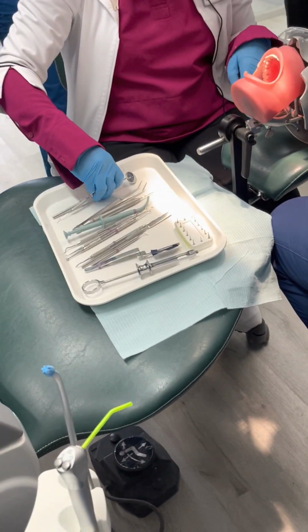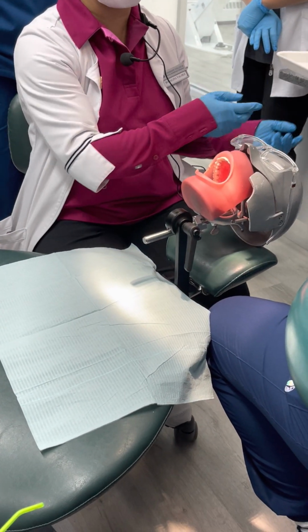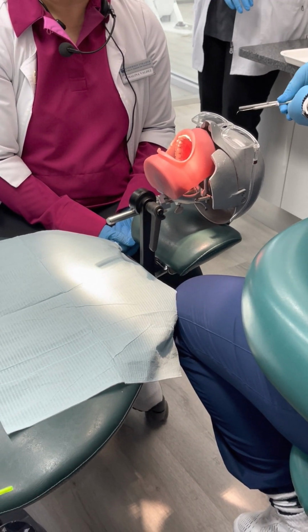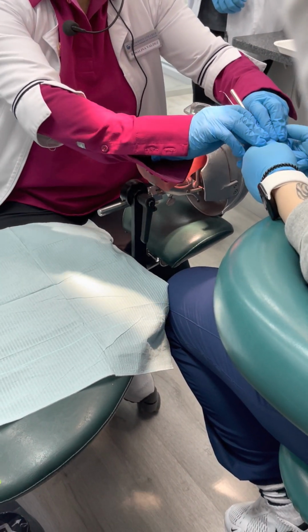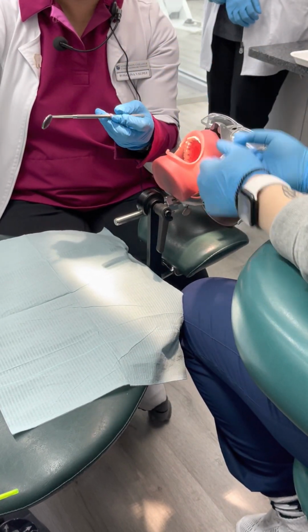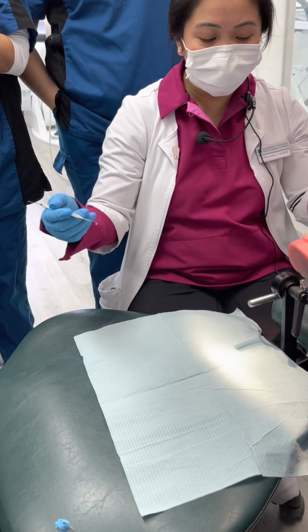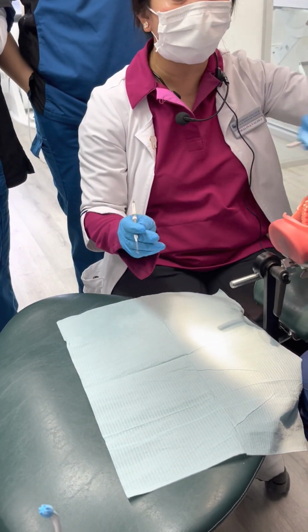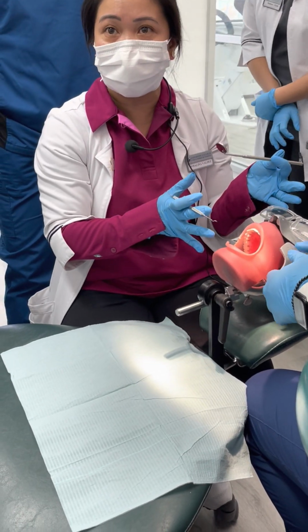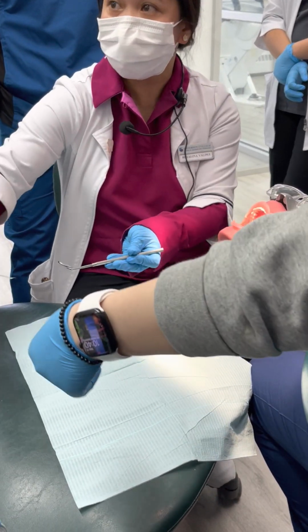So now you pass this together. These are the two instruments that you pass together, right? You're gonna hold it at the side of the instrument. This is 100% of the instrument. The working end goes to the mouth, not out. You're not gonna pass it over the mouth or the face of the patient. Either this side or this side. This is the passing zone.